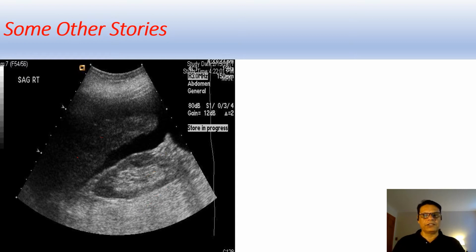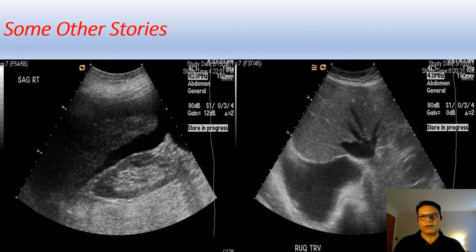So that represents liquid. Truly speaking, ultrasound mainly distinguishes between solid and liquid. Liquid means no echoes, solid means a lot of echoes. And by the intensity of these echoes, we can guess the texture or structure of internal organs.